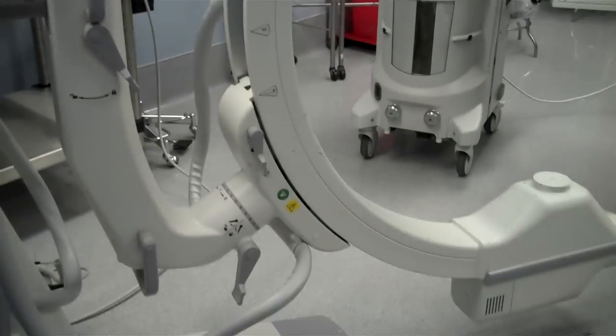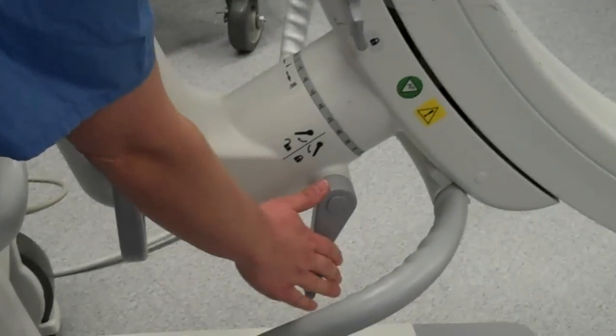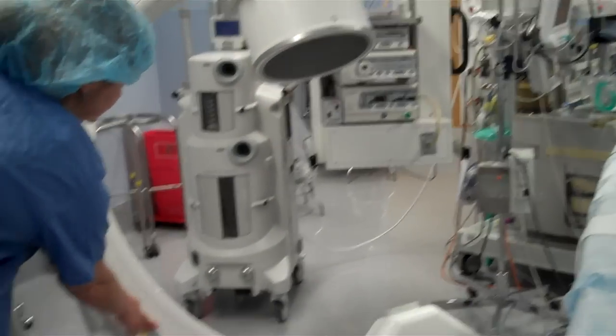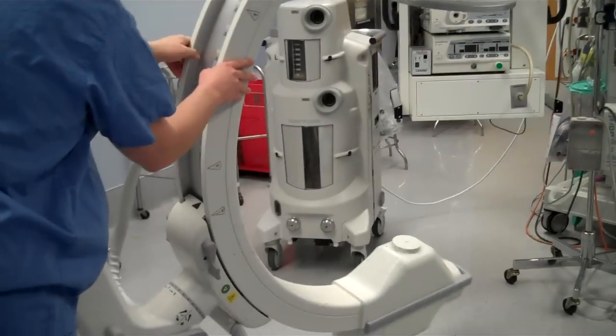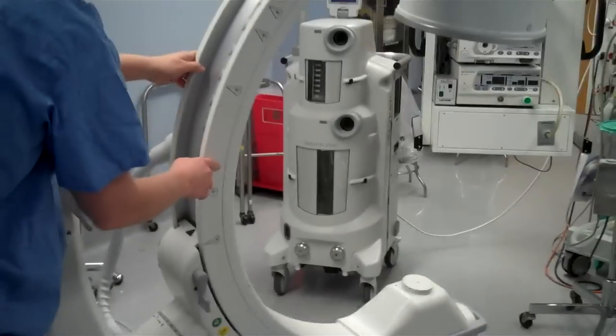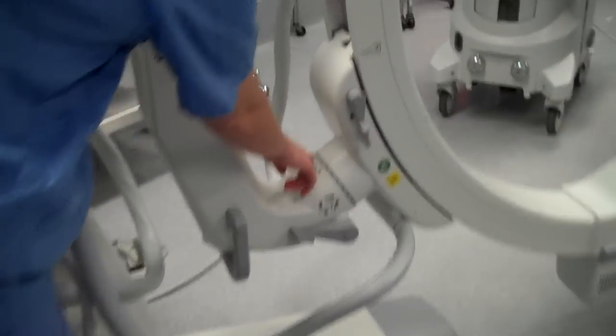The last lock is the one that we use the least frequently. It's called the orbital lock, and the release for that is right here. It moves the C-arm in an orbital fashion. To zero it out, I'm looking right here.